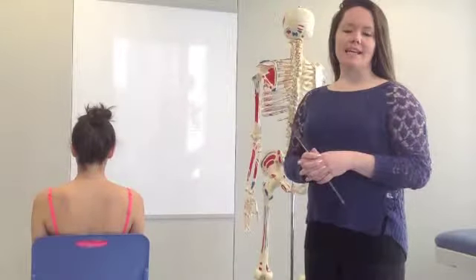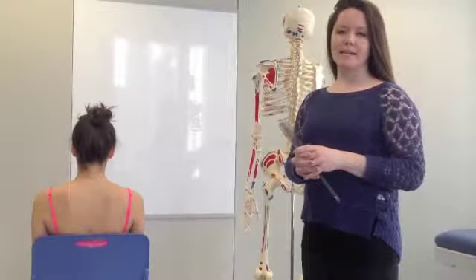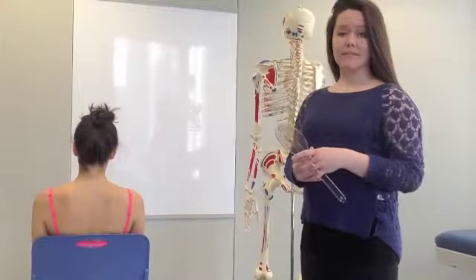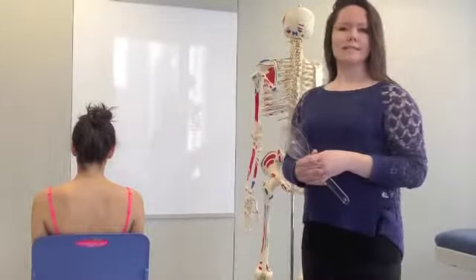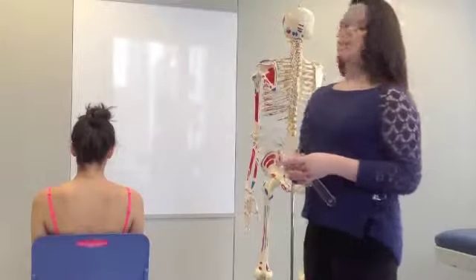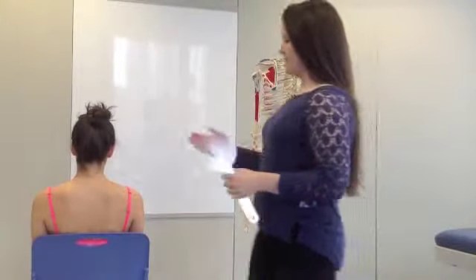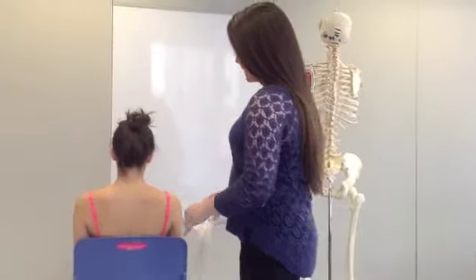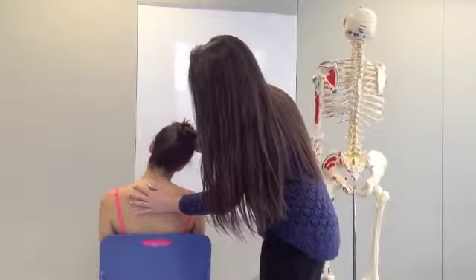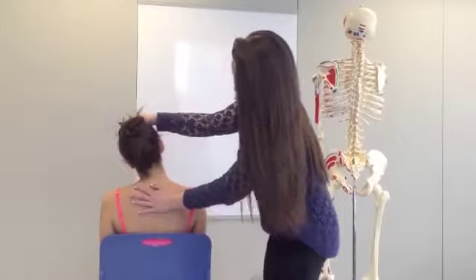Specifically, we're looking at any limitations to motion that might be caused by either abnormal tightness in the musculature in the neck and the cervical spine specifically, or any ligamentous or other structure impairments. When you're looking at cervical side bending, we're looking at the motion in the frontal plane. So, for example, on Kelsey, we would be looking at just this pure motion here, and then just like so.